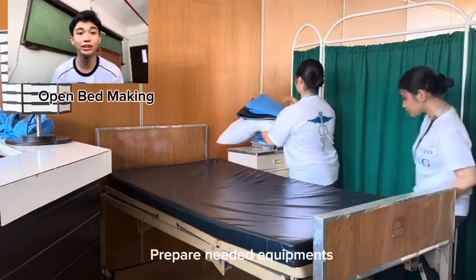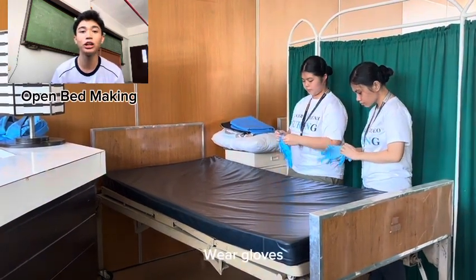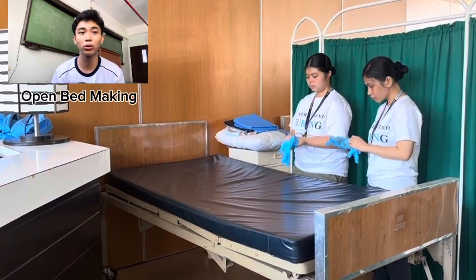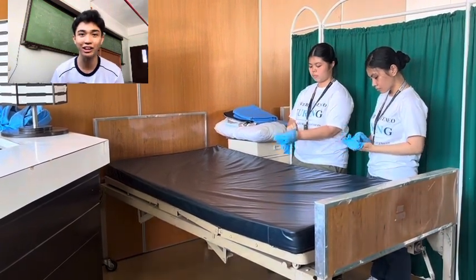First type of bed is the open bed. This typically refers to a bed in a hospital or healthcare facility that is available for a new patient to occupy. When a bed is open, it means that there are no current patients assigned to it, and it's ready for admission of a new patient who needs nursing care.